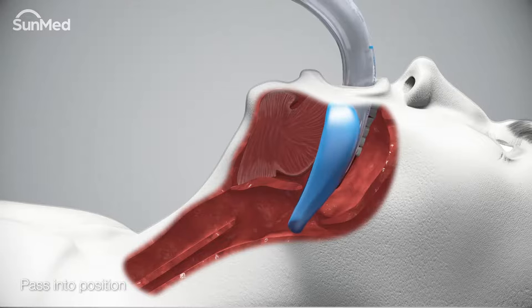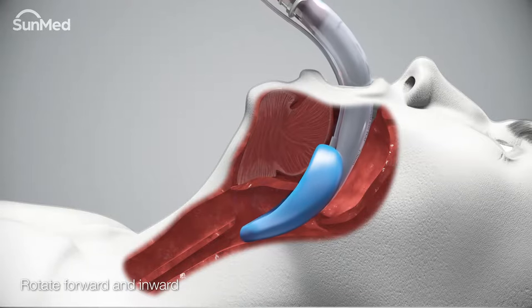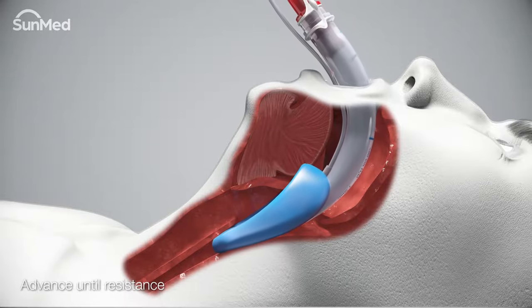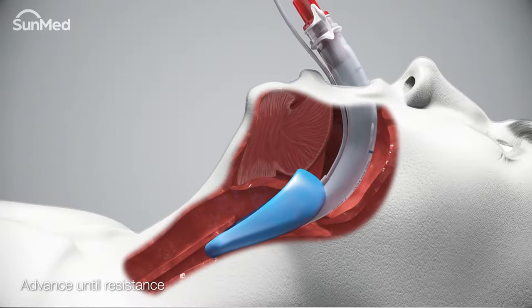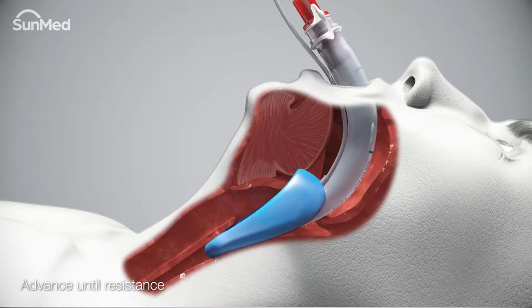Rotate the air Q3 airway forward and inward, aiming for the base of the tongue. Minimal manipulation may be necessary to turn the corner into the upper pharynx. Continue to advance until fixed resistance to forward movement is felt.